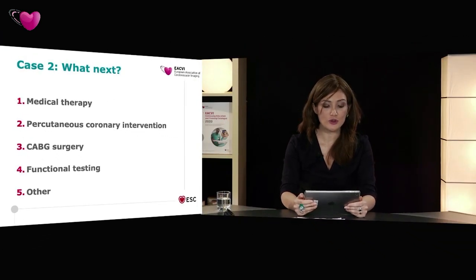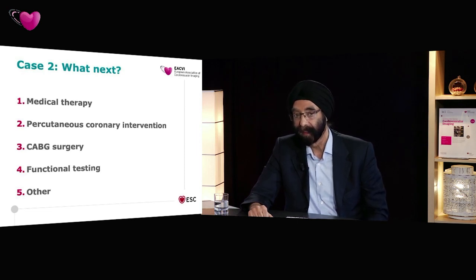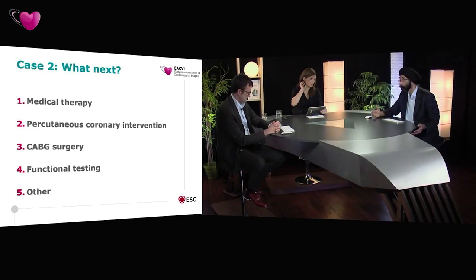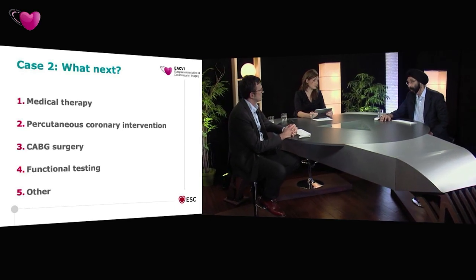Do you use contrast in every stress echo? We use contrast in the majority of stress echo. I would say we use it in 85 to 90% of patients. If the images are really excellent without contrast, and the patient has a low likelihood of coronary disease, and we're seeing more and more of these patients, to be honest with you, we may avoid contrast.